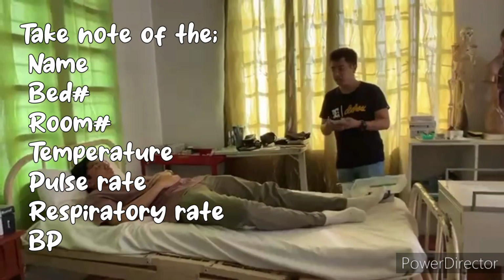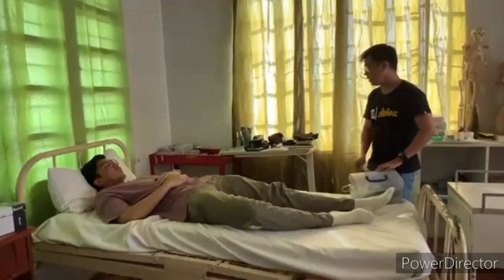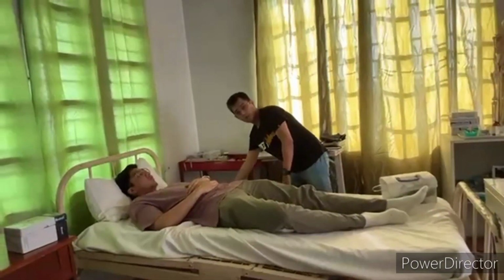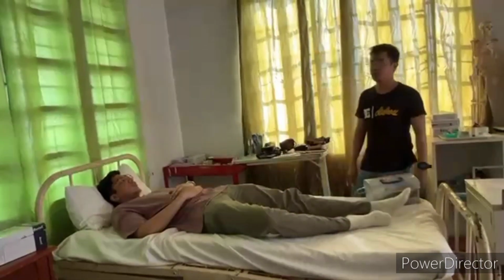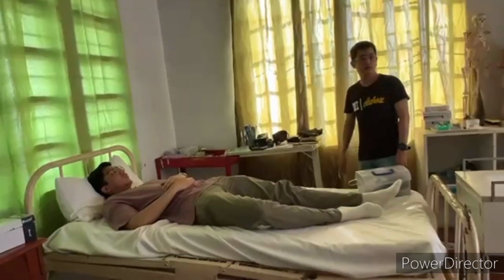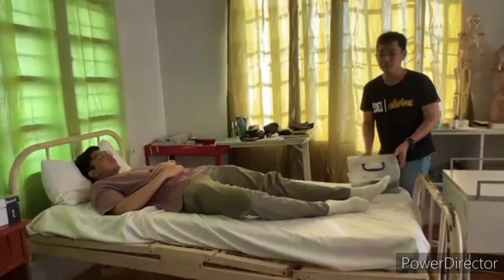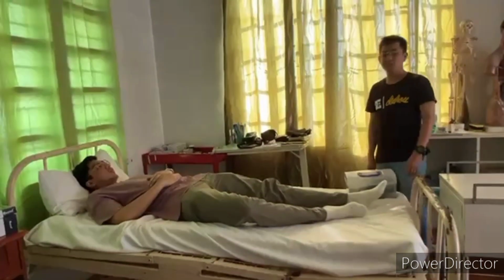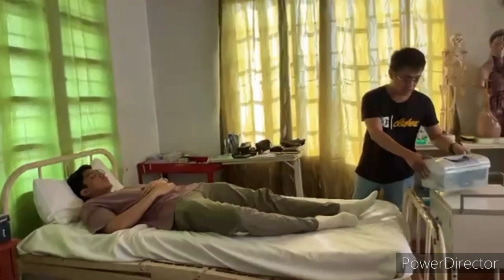So after getting the patient information, we also have to adjust the bed to its working level. So adjust it for about 20 to 30 degrees. Okay, and then after doing that, we also have to make sure that the room is well lighted and there is a good ventilation inside the room. Okay? So after doing that, we can now start getting the vital signs of the patient.